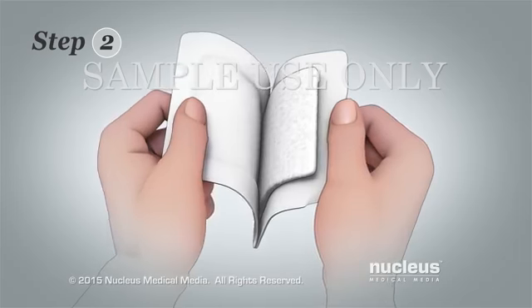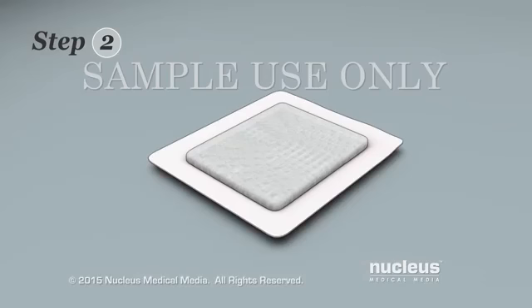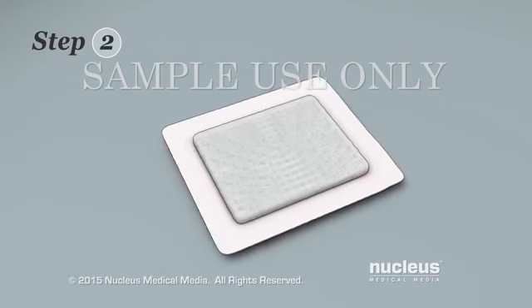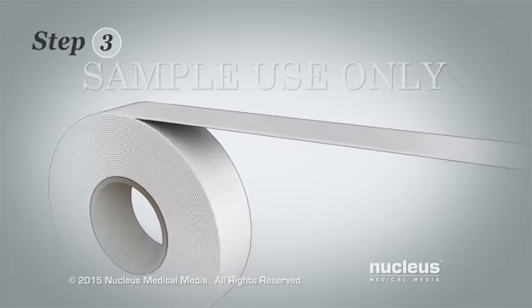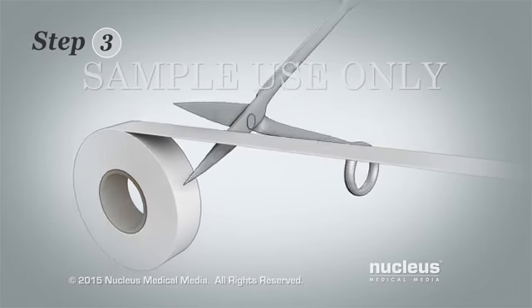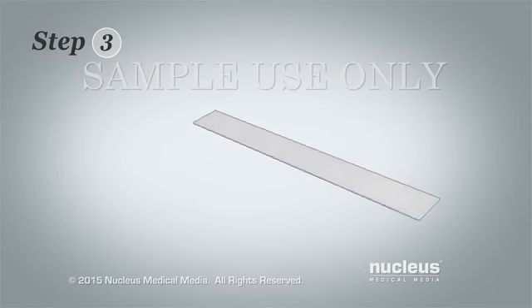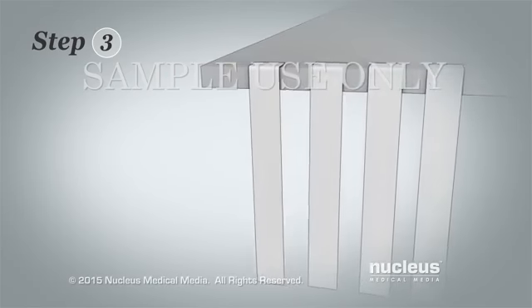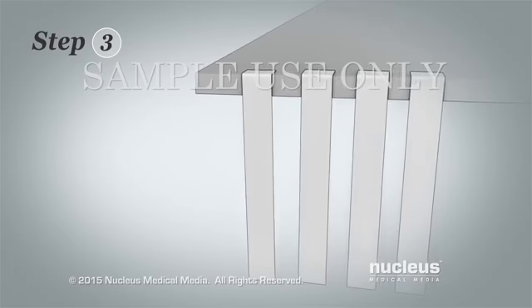Step 2. Open a new bandage wrapper. Leave the bandage inside the wrapper and be careful not to touch it. Step 3. Cut 4 pieces of tape and hang them from the edge of a nearby table or counter. The pieces of tape should be the same length as the old ones around your incision.